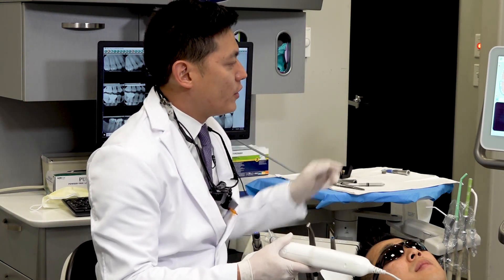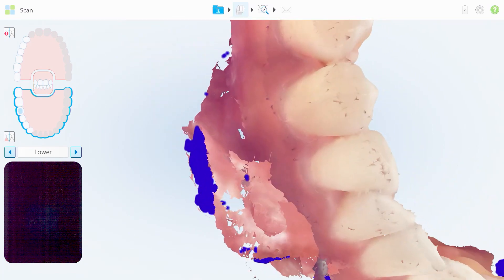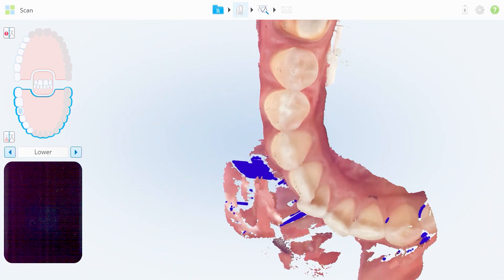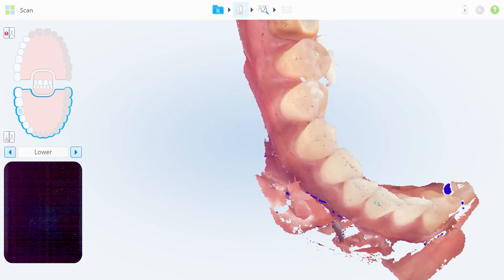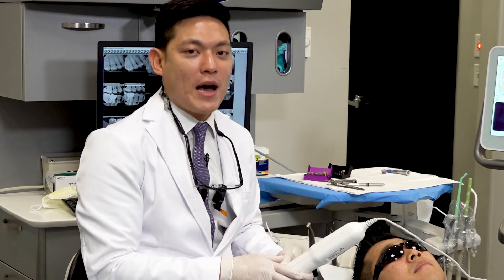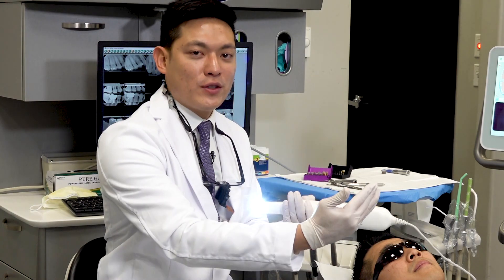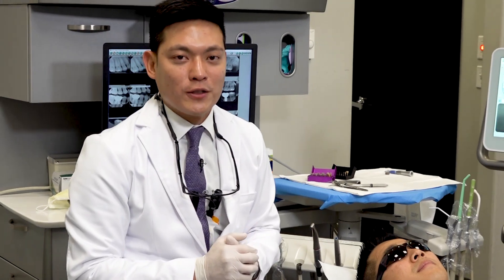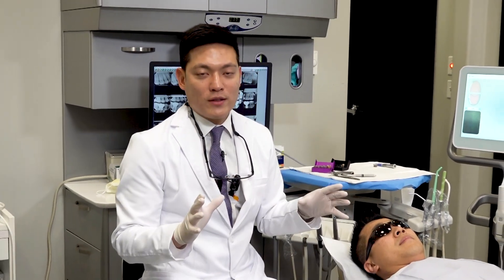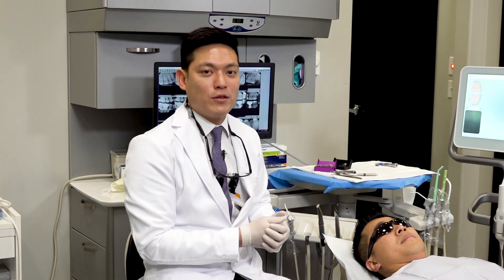As you work your way toward the anterior region for full mouth scans, go slowly but also build in this new data to the digital model slowly — slow rotations, light rotations from the incisal. Analyze the model as it generates. If we zoom in on the anterior area, you want to make sure the teeth are generating correctly. With those misalignments you may see layers to the teeth, which is usually an indication that some sort of misalignment occurred. Analyzing your digital impression throughout this process is going to be very important to the success of your cases.